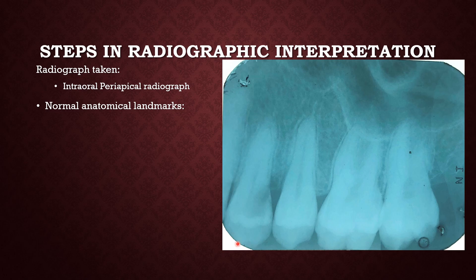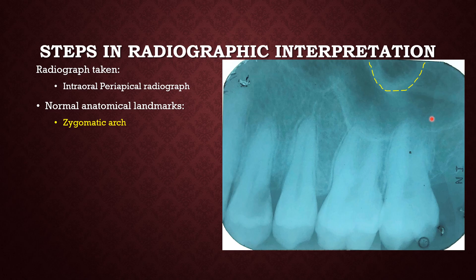Let's look at this radiograph. First of all, we need to analyze that it is an intraoral periapical radiograph and from the appearance, it looks like it is the second quadrant. The normal anatomical landmarks seen here: the yellow line is your zygomatic arch, the purple line is the floor of the maxillary sinus. We also see another shadow in the posterior part of this maxillary radiograph which doesn't really belong to the maxilla — it is the coronoid process of the mandible, visible on most posterior parts of most maxillary molar radiographs.